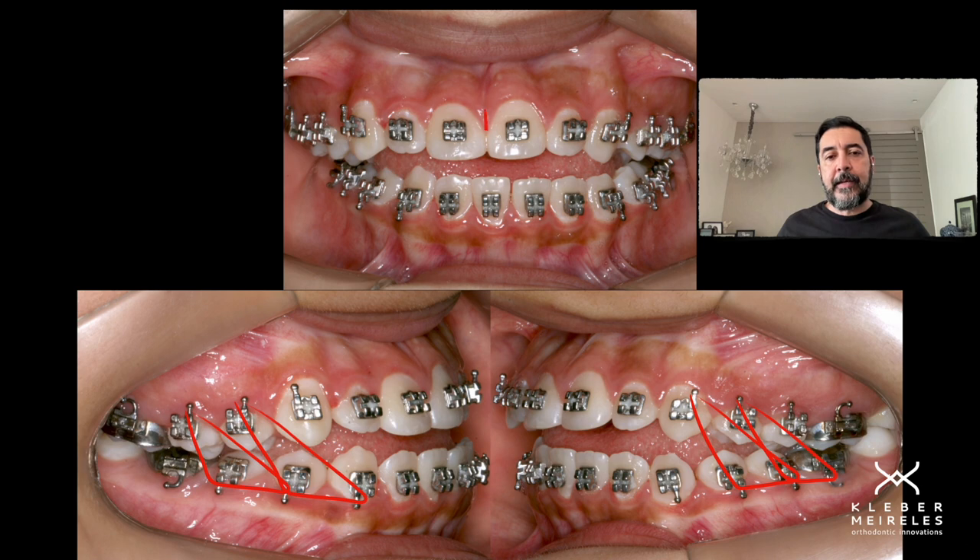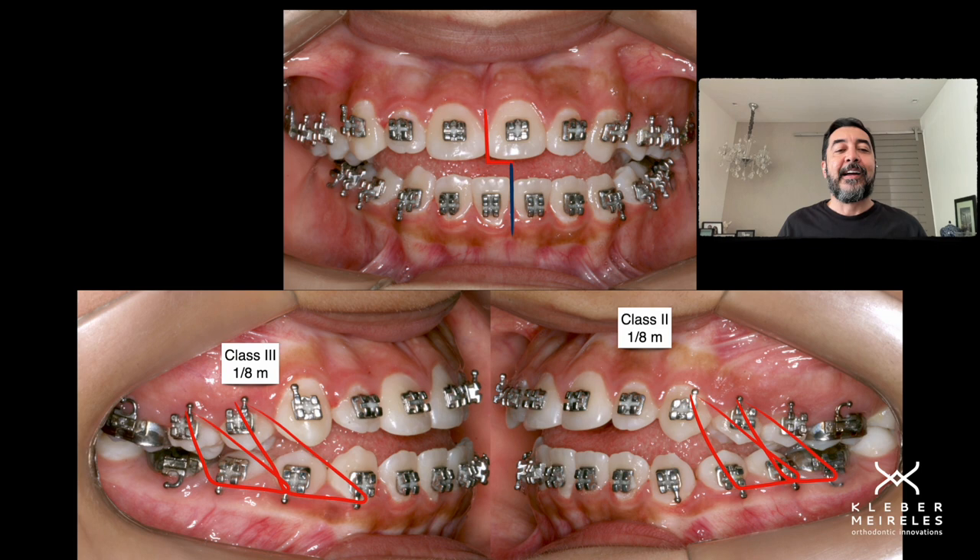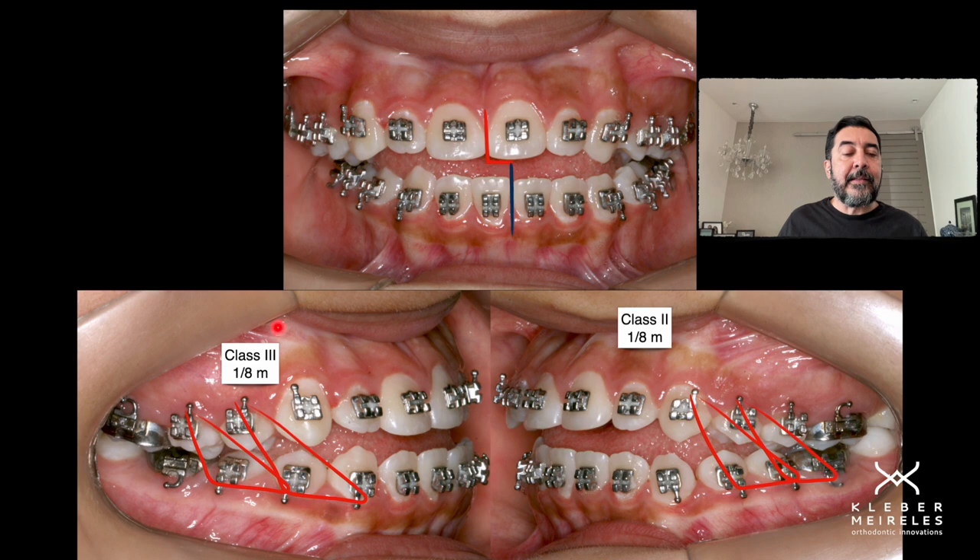Here we have the clinical case. I sometimes have the opportunity to photograph with the elastics in position, but in this case I didn't, so I need to show you how it was worn by this patient. One-eighth medium on the right side, with a shape that is going to correct the class III as well — a vertical plus a class III vector.